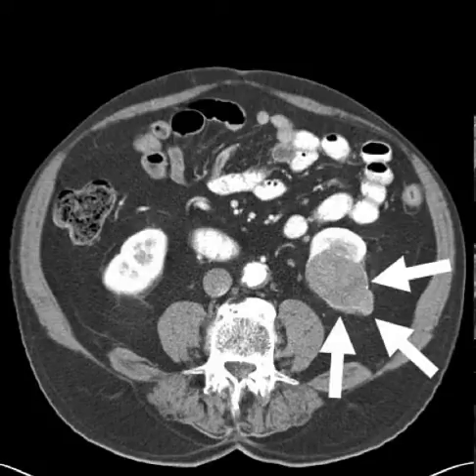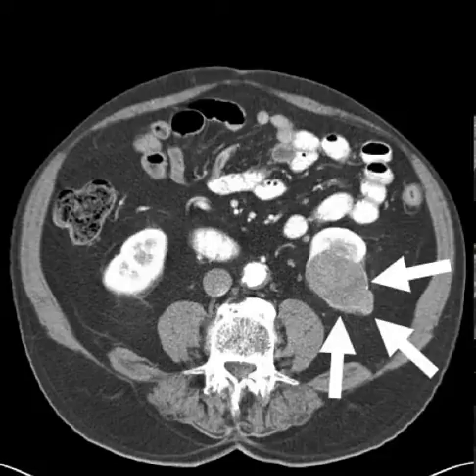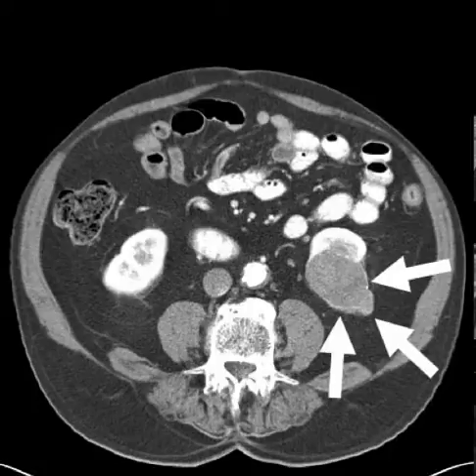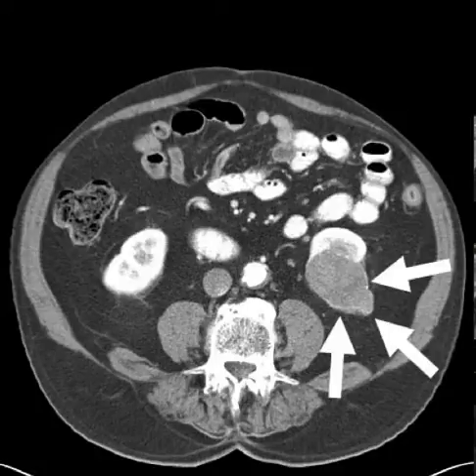Additionally, something that's important to know is that T2 brightness in a renal lesion that's suspicious needs to be further evaluated with a dedicated renal mass protocol. This is something that we often see when we're doing lumbar spine MRIs or some other type of study that lets us see the kidneys and we see a T2 brightness. If it's not really entirely homogeneous, we cannot just assume that it's going to be a cyst because it's T2 bright. So that's something to have in mind.